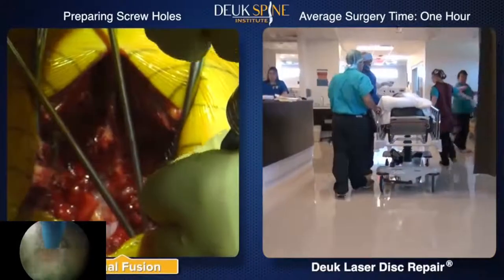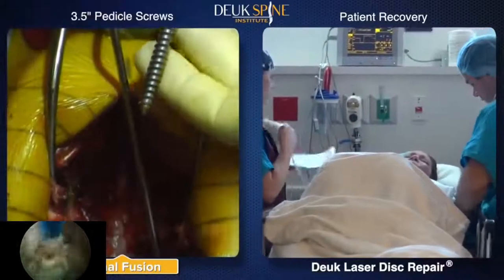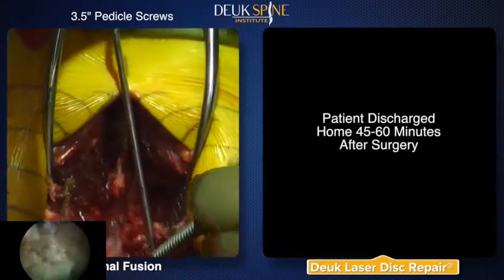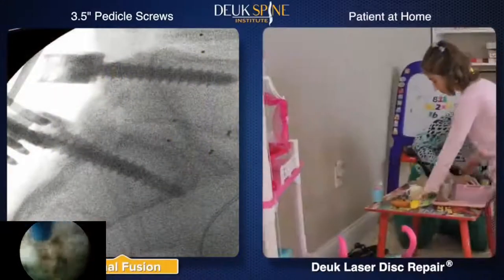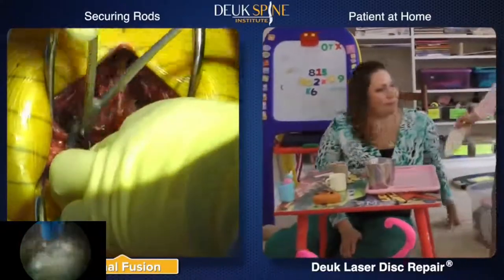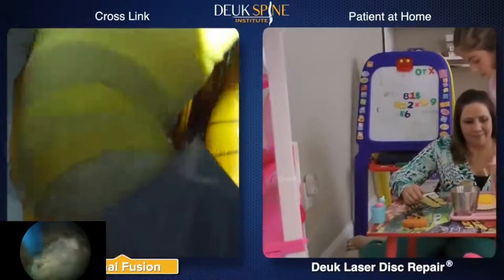The fusion, however, is still underway. Holes in the spine must be tapped in preparation for the large pedicle screws that anchor the fusion hardware. The Deuk laser disc repair patient is in recovery usually 45 to 60 minutes before release to go home. The fusion screws are inserted into the bone, as shown in the X-ray. After all screws are in place, rods are used to connect the screws together to prevent movement of the secured vertebrae. Cross links are added to bridge the rods together for additional stability.